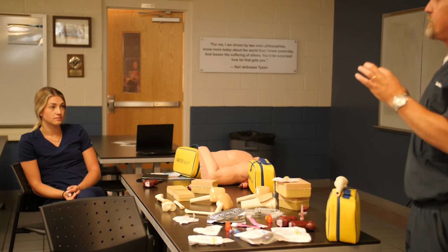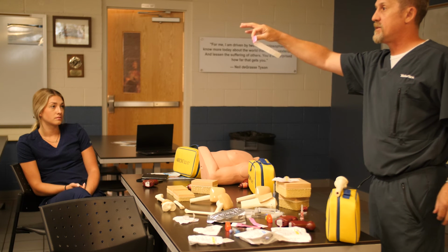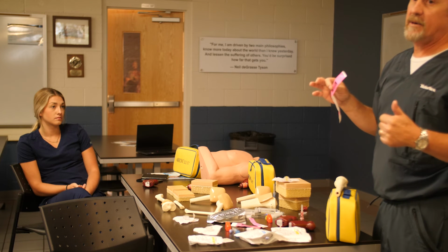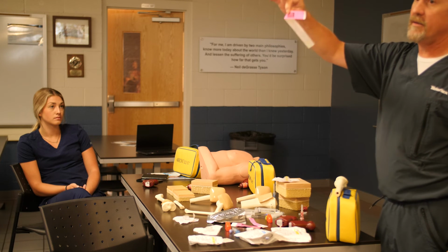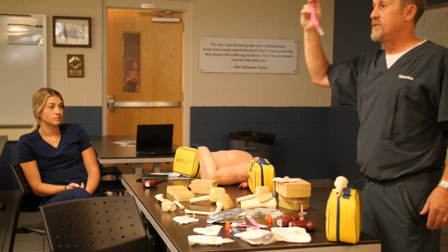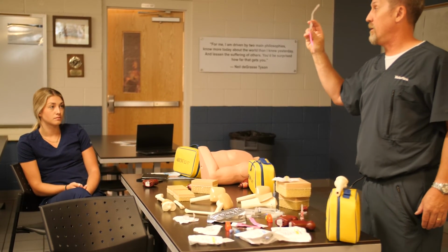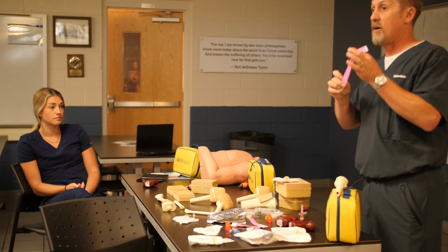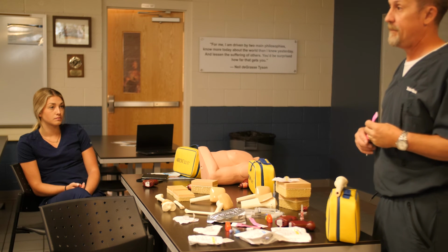The other really nice thing about this pink bracelet is that there's an 800 number on here, and we have clinical staff, nursing staff, manning this phone 24/7. If you ever have any questions about insertion, removal, meds that you're putting through, blood draws, anything like that, you can call these folks and they can walk you through any questions that you have. So this bracelet, I know, goes unused probably 90% of the time in most facilities I'm in. I'm just reiterating, guys, this is really important. It's giving people information on when it was placed, so when you're not there anymore, they know when they have to get it out, but it also gives you a tool right there. If you ever have any questions, you have a resource right there, okay?